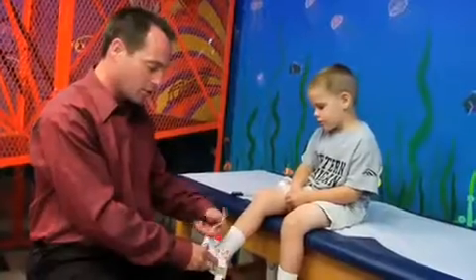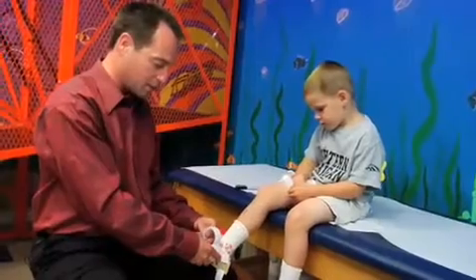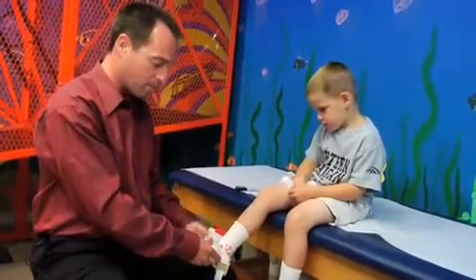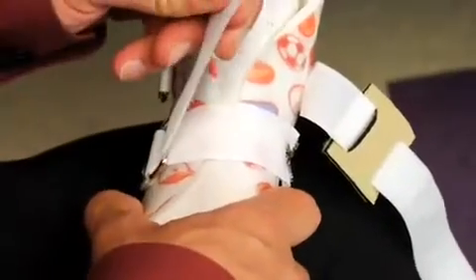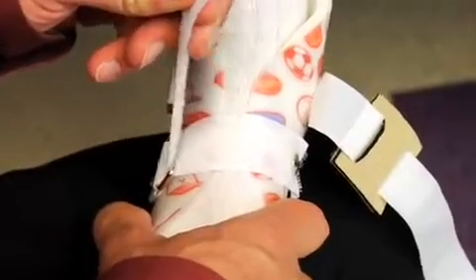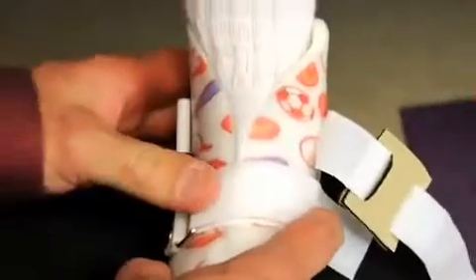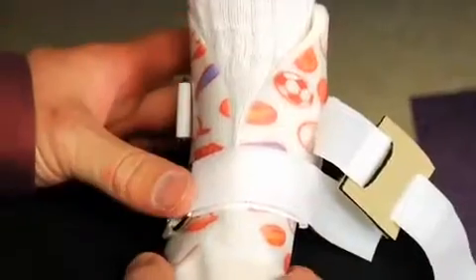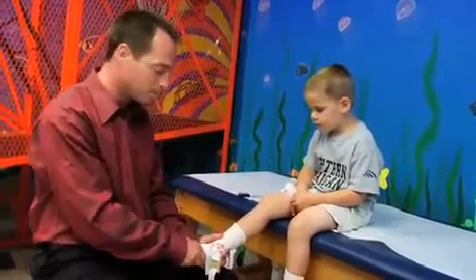The next thing you're going to want to do is tighten it up around the foot. You simply take the distal strap, pull it through the chafing loop, and make it tight — not snug, but actually very tight. In tightening this, we're going to create the compression. The pressure is distributed evenly around the foot, so this is not an uncomfortable thing for the child.